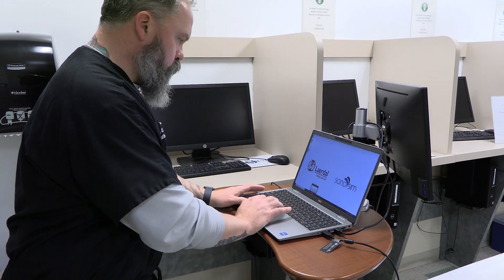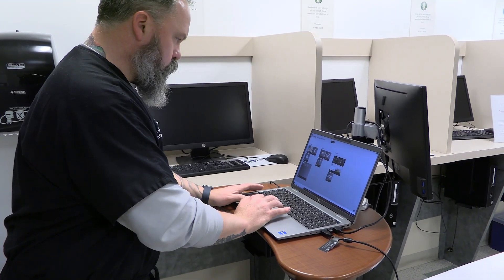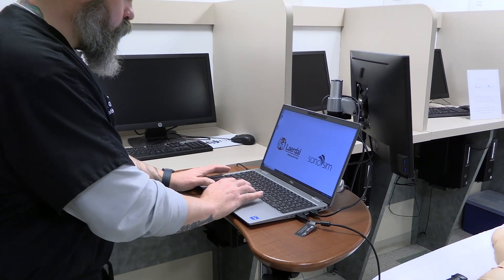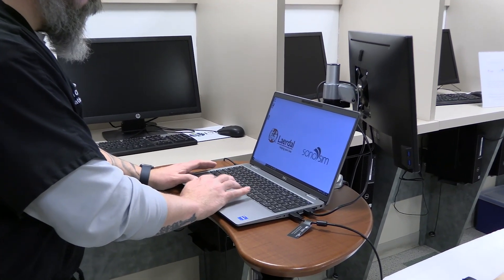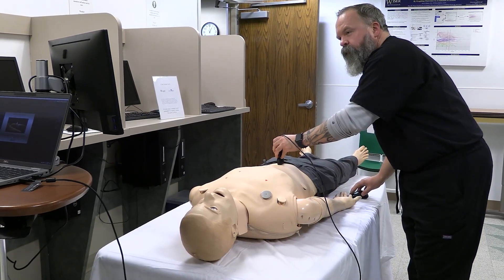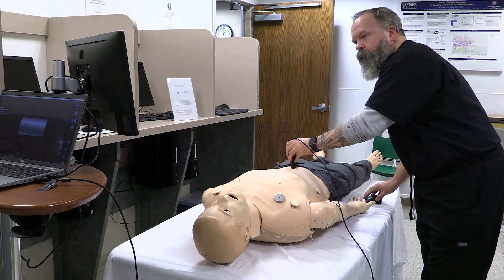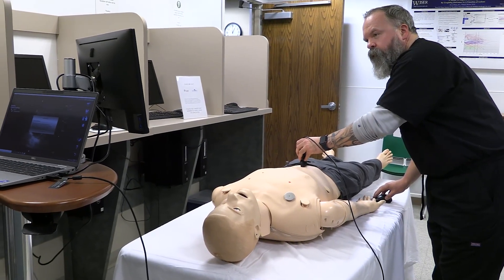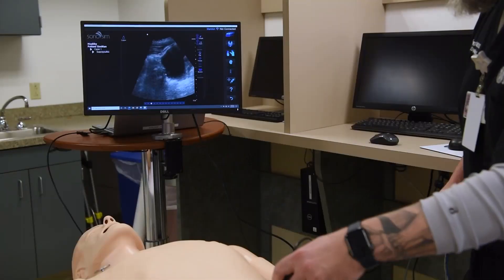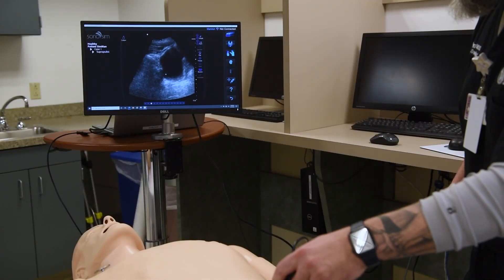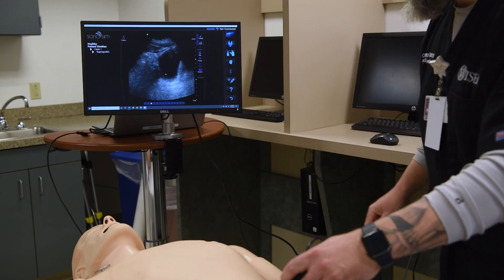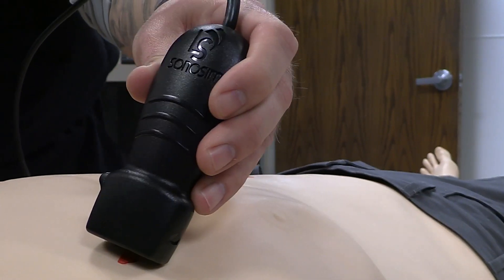Hello, everyone. My name is Clinton Clegg. I'm a simulation specialist here at Wiser. I'm here today to talk to you about Laerdal Sonosim Ultrasound, a new tool we have here at Wiser. The Laerdal Sonosim Ultrasound solution features a new ultrasound interface and improved integration with Leap. These two elements provide users greater flexibility and control of the ultrasound images used within ultrasound training simulations.